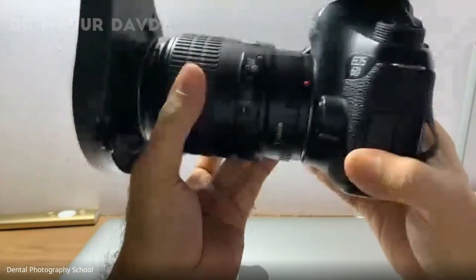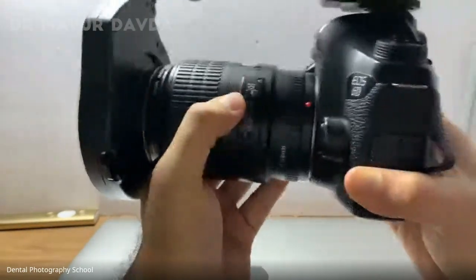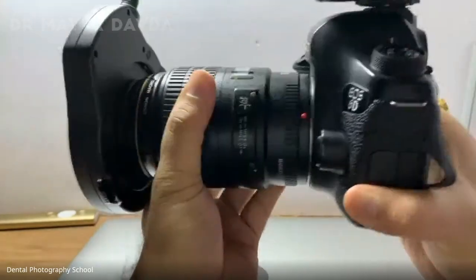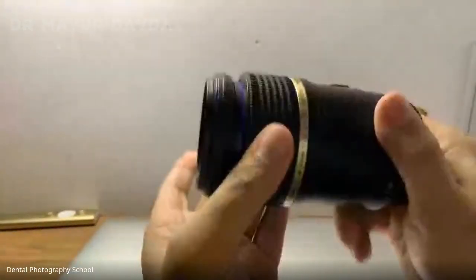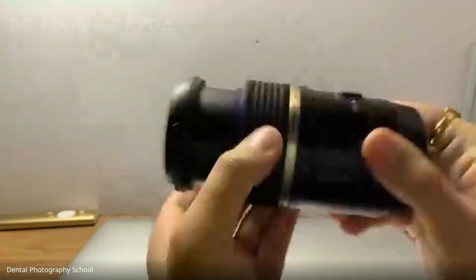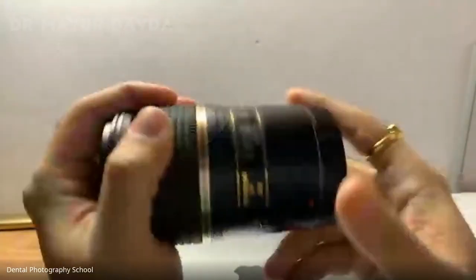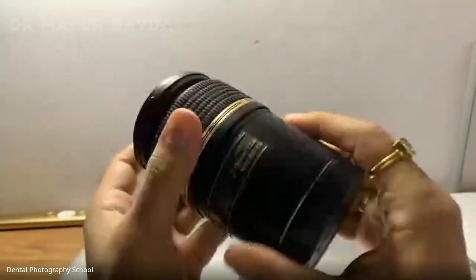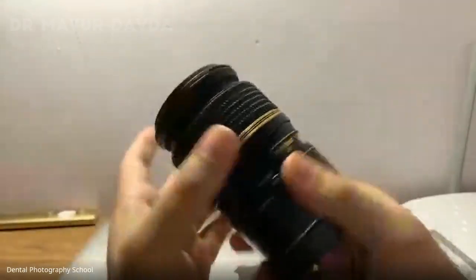So what I was saying is, in Canon lenses, whenever you are focusing, it's not going to change the lens dimensions. But whenever you use a Tamron lens, you can see that it's going to change the lens dimensions. So even the ring flash is going to be moving with it. It's a ridiculous lens to have. It's very plasticky, very light in weight. It actually feels like a toy. And the worst thing is magnification ratios are not seen properly.